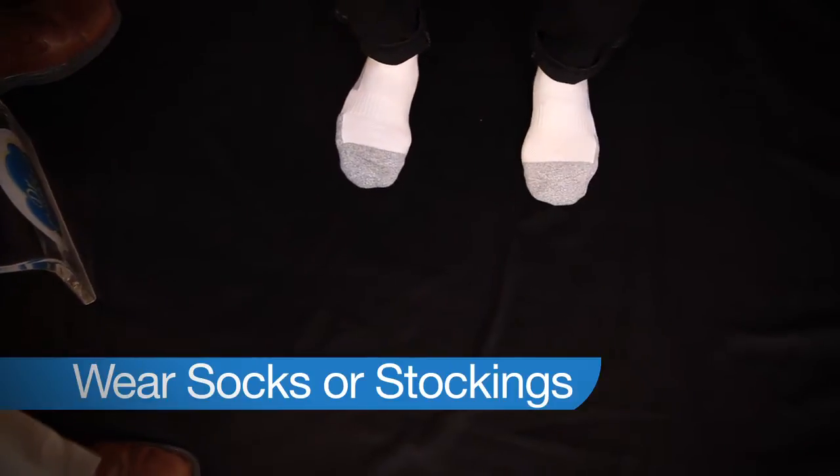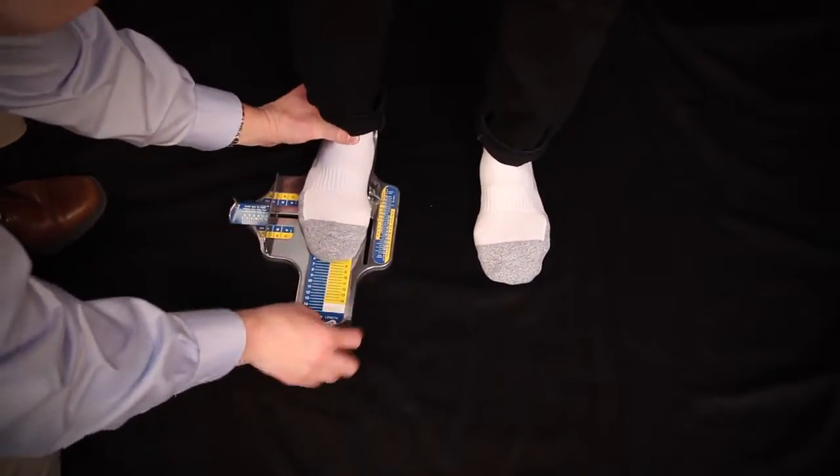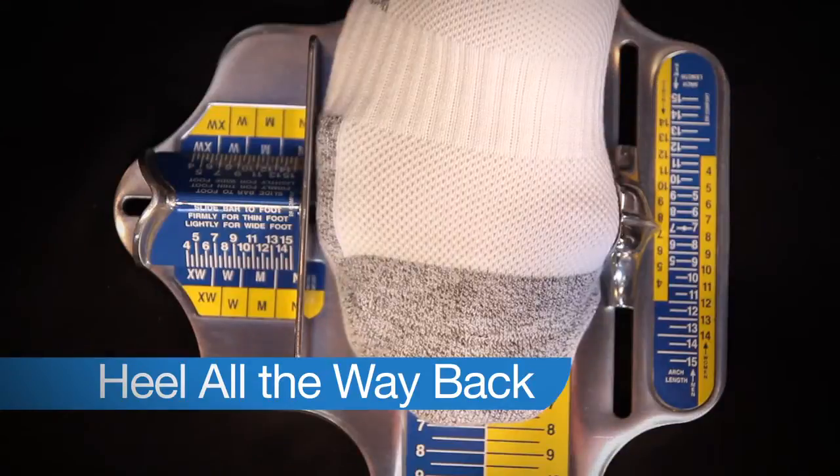If you will also notice, Jane is wearing socks. And you want to have the patient wear socks or stockings, preferably the socks or stockings they'll be wearing with the shoes. Now the first step is to make sure that they're properly placed on the Brannock device with the heel all the way back. And you'll see I grabbed Jane's instep.